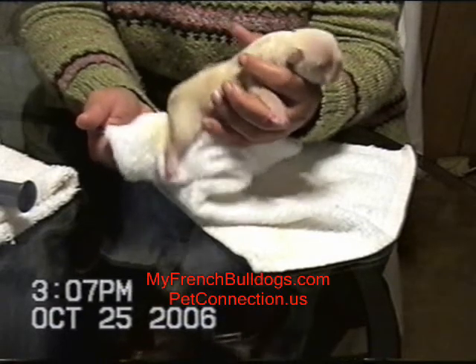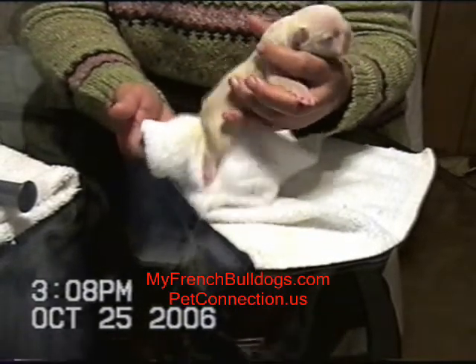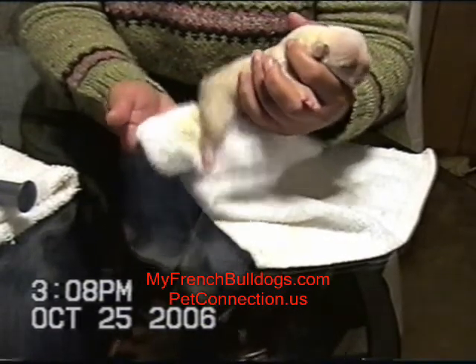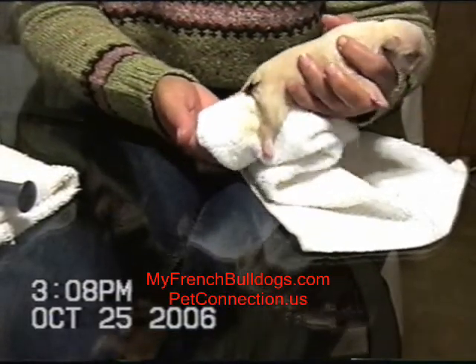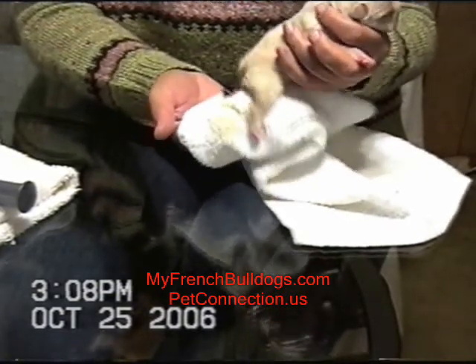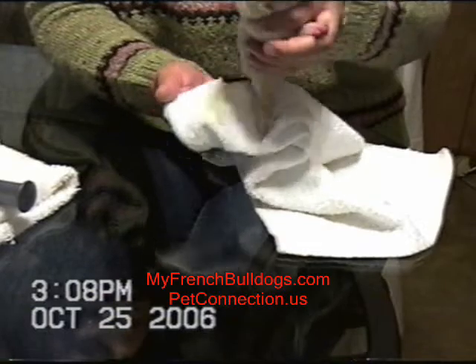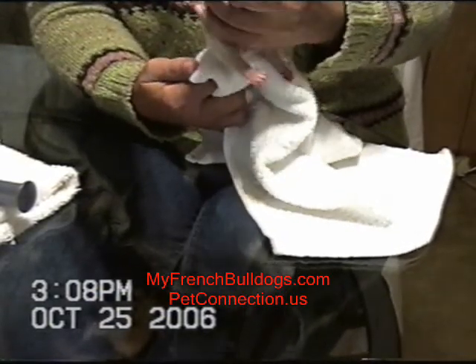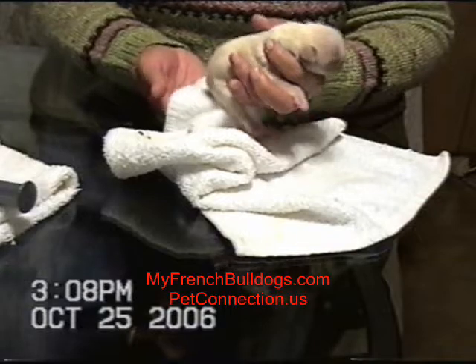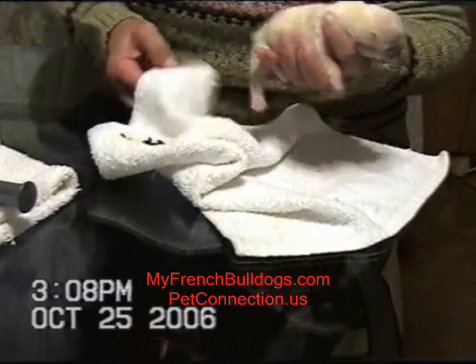As you see right now, I'm bouncing the puppy in an attempt to get him to urinate and defecate. You want to do this every time you feed the puppy as well. The mother normally does this, so if you've got a mother that's able to do this, you can give the puppy to the mother and let her do this after you've fed them, if she's not feeding them herself. A lot of the times, though, when you're tube feeding, it's because you've just had a C-section and the mother is not able, due to the drugs of the C-section. She doesn't really know about the puppies yet, and she really doesn't want to take care of them, feeding them or cleaning them. I've had it happen every way. Sometimes you've got one that won't feed, but yet she'll take care of them, and sometimes the milk is not in yet because of the C-section or any number of other reasons.